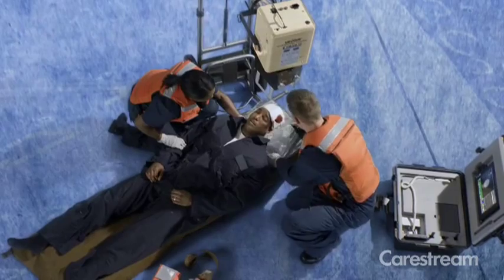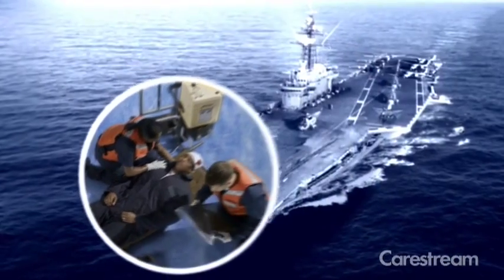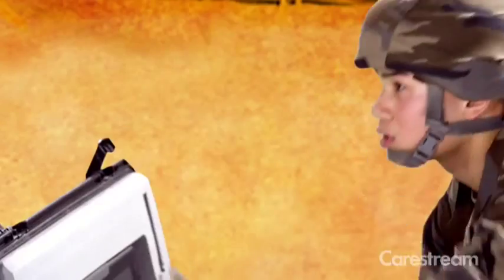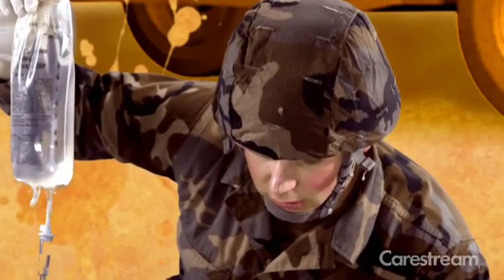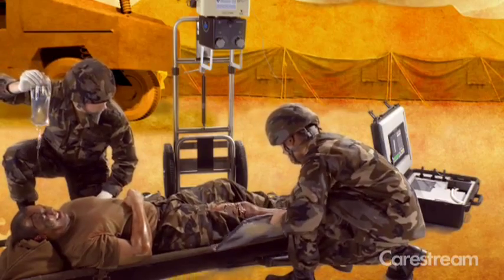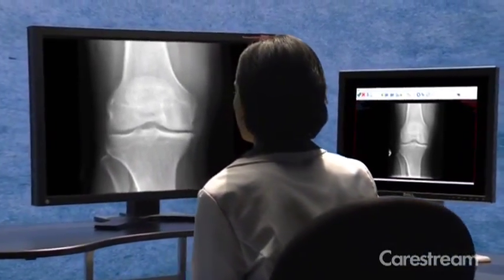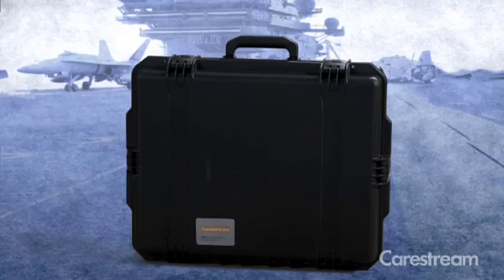We understand that reliability in the field is of the utmost importance. The DRX transportable field unit is designed and tested to withstand the rigorous conditions of military, disaster and remote locations. Backed by CareStream's worldwide support team of product and industry specialists, the DRX transportable lets you focus on what's most important — your patients.